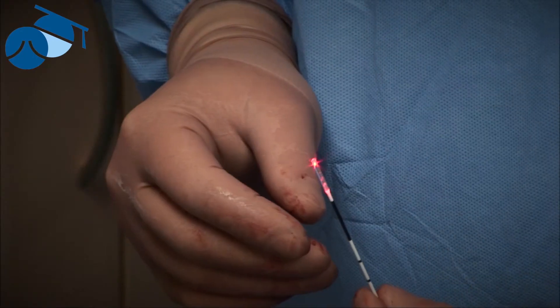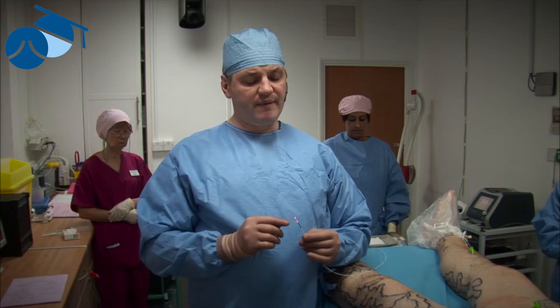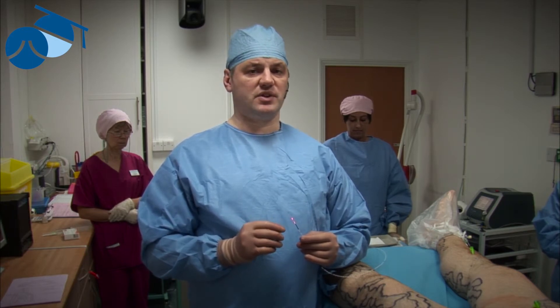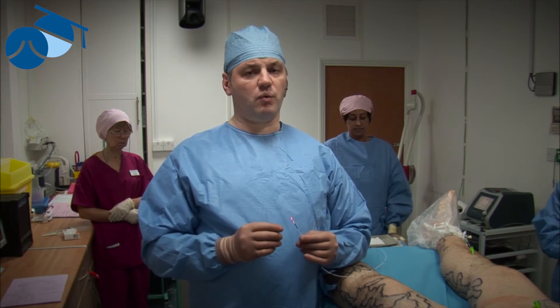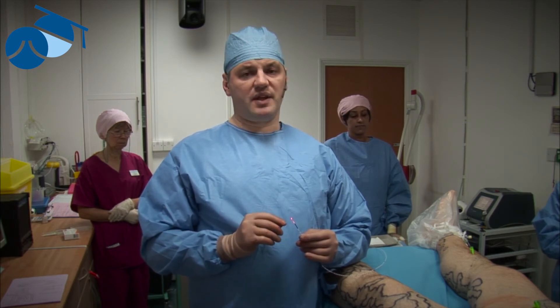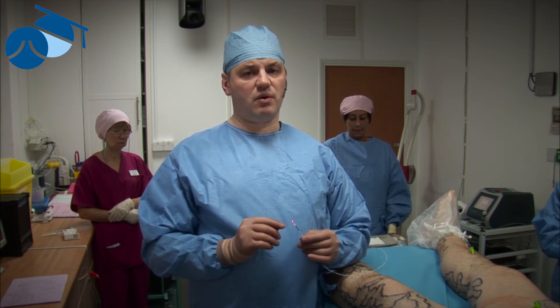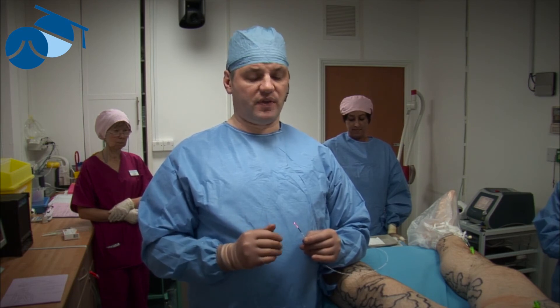This new device is a radial firing laser, where all the energy comes out at right angles to the end. So using our ultrasound, we can position the end of this laser exactly where we want to start treating the vein. When we turn the laser energy on, we know that the vein treated is within a millimetre of exactly where we can see on the ultrasound. This means that rather than guessing two centimetres away from the top of the vein, we can put this right to the area we want to treat, start treating, and pull back at a set rate to get a perfect closure every time.